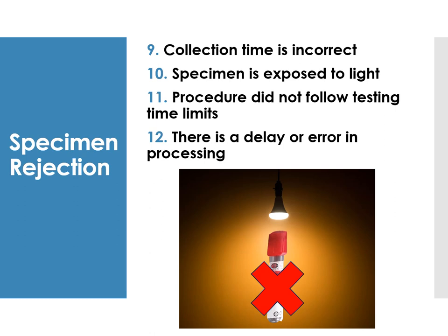Additional rejection reasons include: incorrect collection time, specimen exposed to light, procedure did not follow testing time limits, and delay or error in processing. For example, bilirubin specimens must be protected from light at all times — wrapped in carbon paper or aluminum foil.